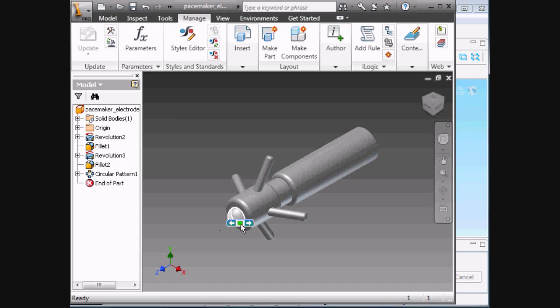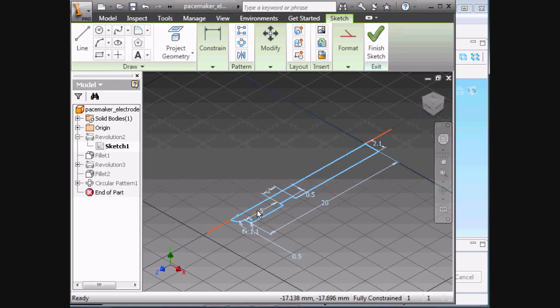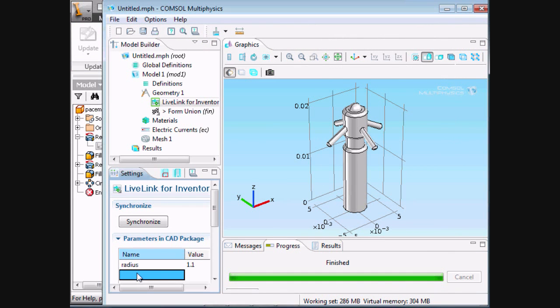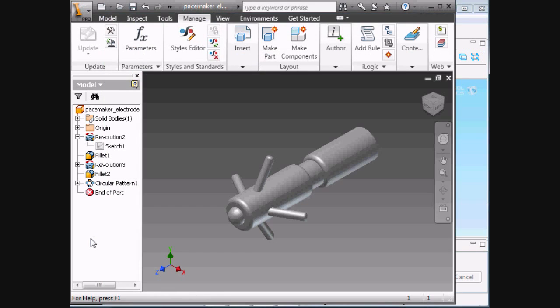Now suppose we want to change a model parameter, but we don't know which one to change. We can simply edit the sketch and choose the one we want. Now because we want to change the location of the ground, we double click on that parameter, and here we see that the dimension is D14. We exit the sketch, go back to COMSOL, and enter D14 here, and change its value from 5 to 10. As soon as we click Synchronize, the CAD model is updated in both COMSOL and in Inventor.